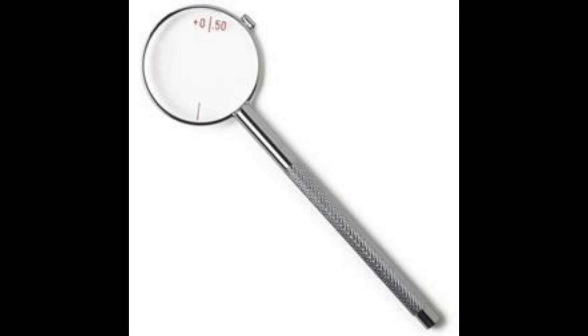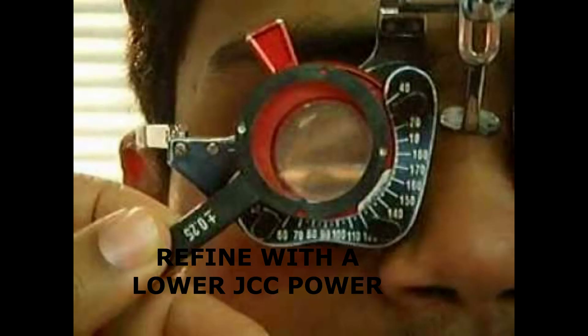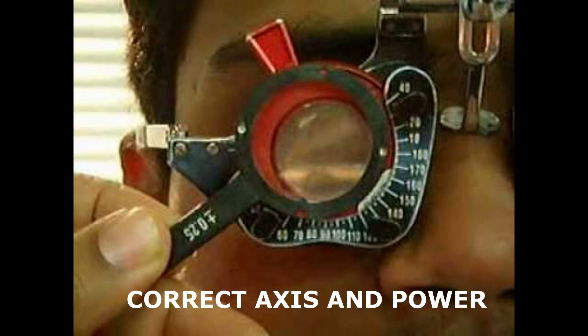To refine, you can use a smaller power of the Jackson Cross Cylinder, like 0.25 diopters, to get the exact power. When the patient indicates there is no difference between the two sides of the Jackson Cross Cylinder as you are flipping over, this indicates that what is on the trial frame is the patient's correct axis and power. You can end the process here. This concludes how to check if a patient needs a cylinder, how to get their axis, and how to refine the power.